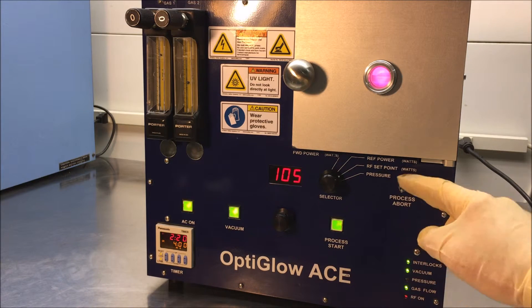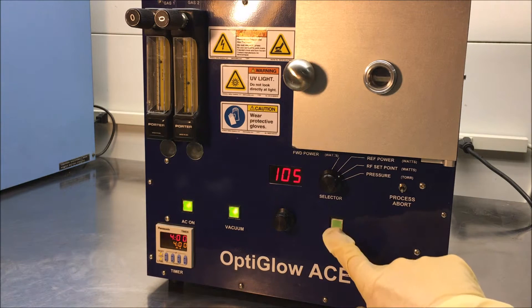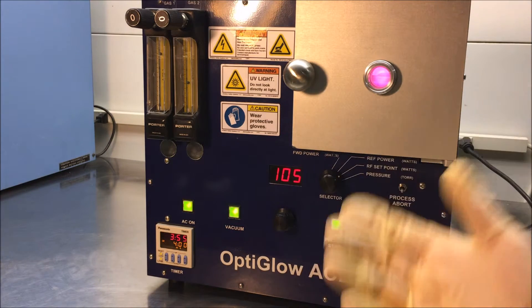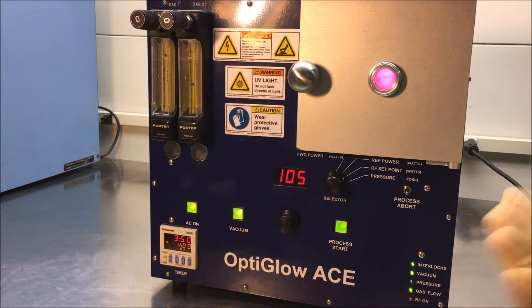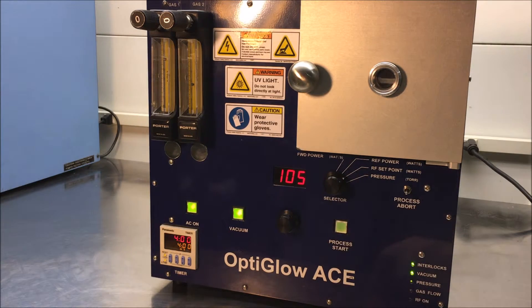Now if we want to stop the process, we simply hit process abort. If you want to start it again, press process start and the system starts up again. Some people would like to purge the system. If they're operating with an oxygen plasma, they want to make sure that they get all the residual air out of the system. So you can go through a series of tests, back and forth to ignite the plasma and then stop the plasma, which will purge the system of any air that might be in the system.